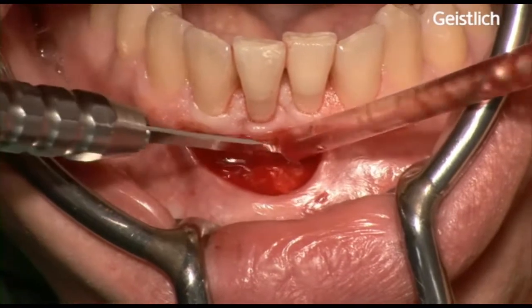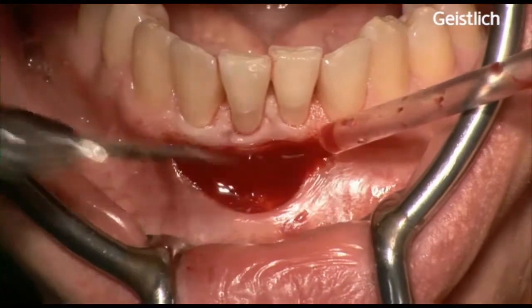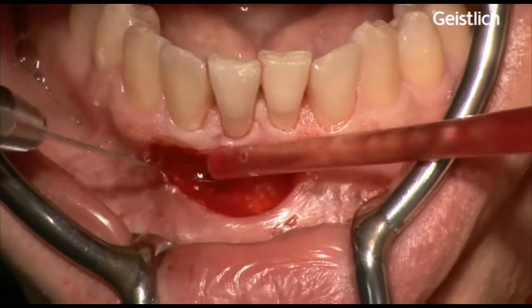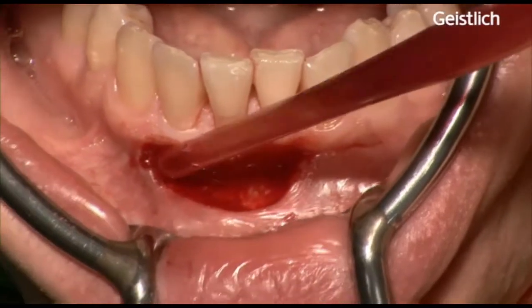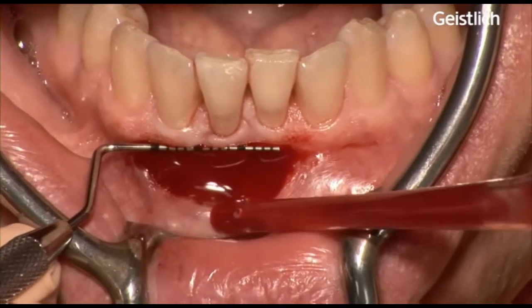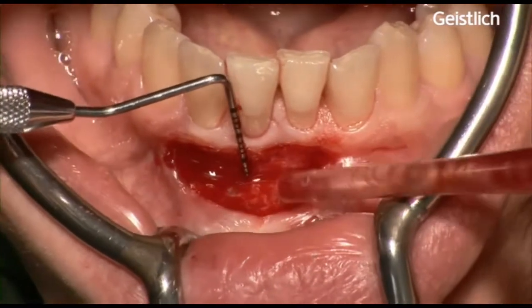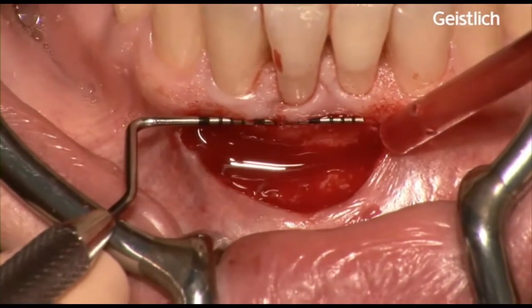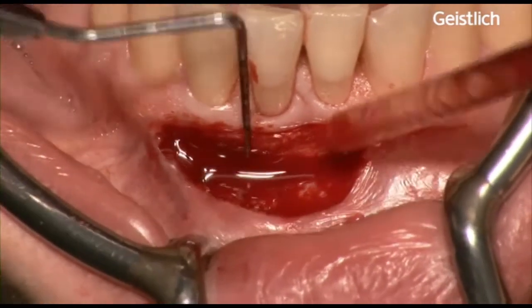In the area where we want a gain of keratinized tissue, an intact periosteum needs to be maintained to protect the underlying bone in the recipient bed for better healing of mucograft matrix when positioned later on. After final preparation of the flap, measurements of the recipient bed are taken with a periodontal probe. In this case, we need a graft or matrix size of 15 mm long and 7 mm for the depth of the vestibule.